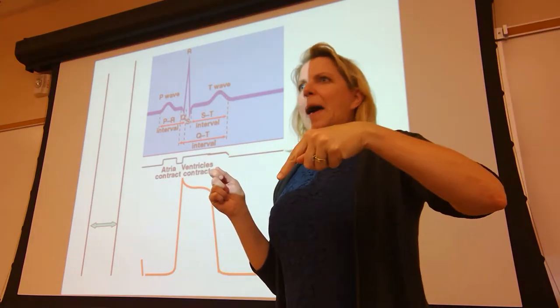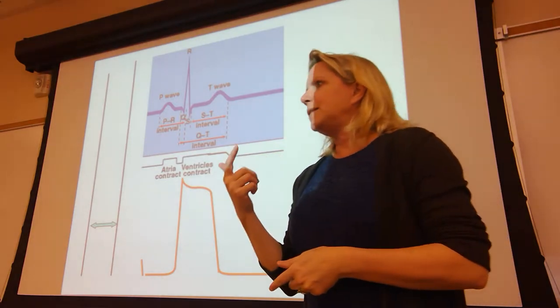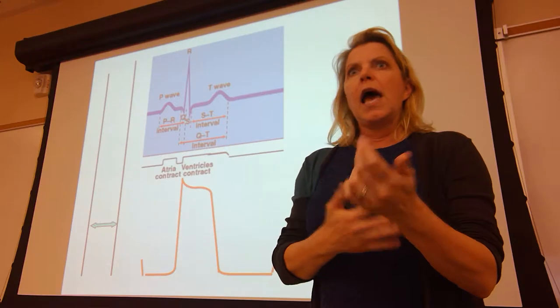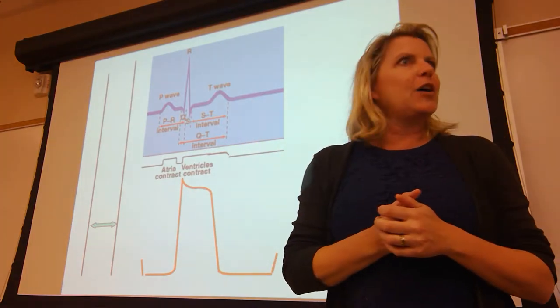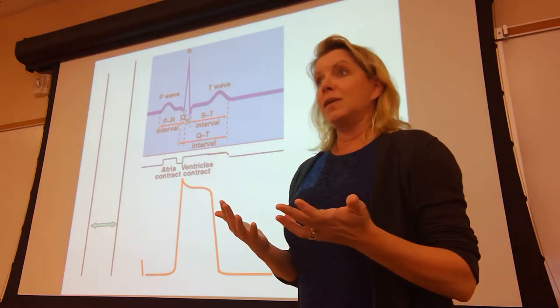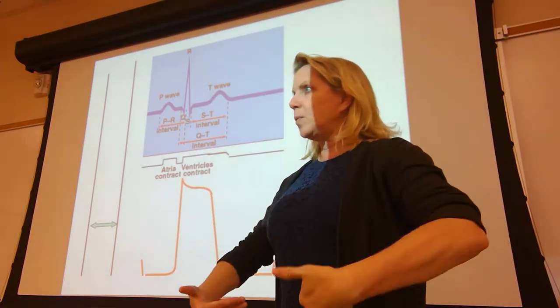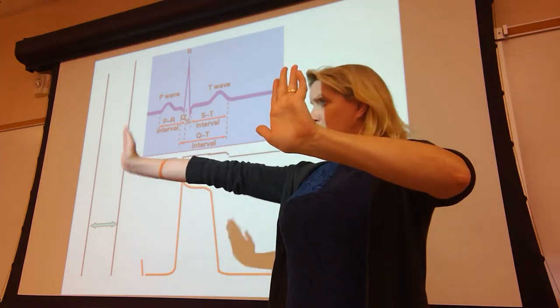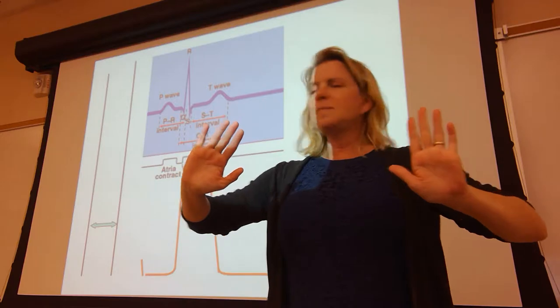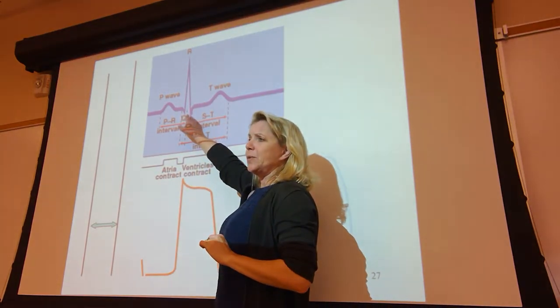So she came to lab last night. Her partners hooked her up. They actually paid attention to her right arm versus left arm. And wouldn't you know, she got a normal EKG because of that. Perfect example of how easy it is to forget its anatomical position. It's your patient's right and your patient's left. So she finally got her R wave to go up for lead 2.